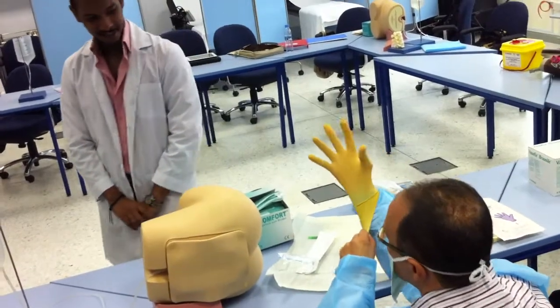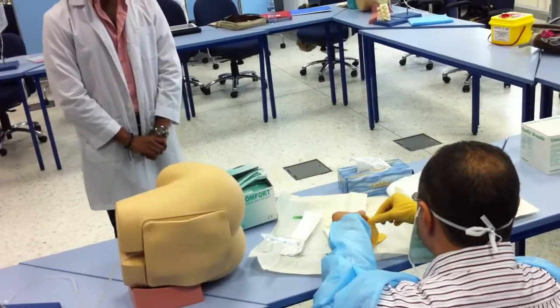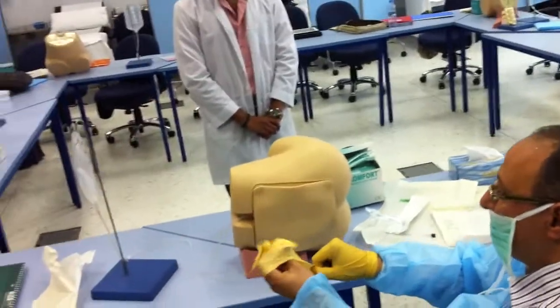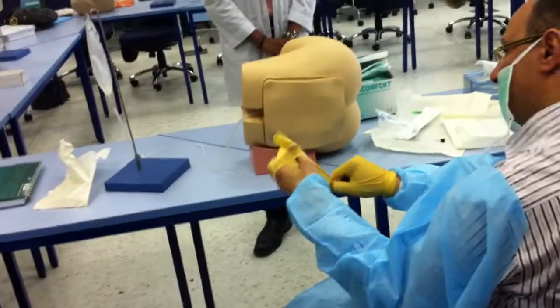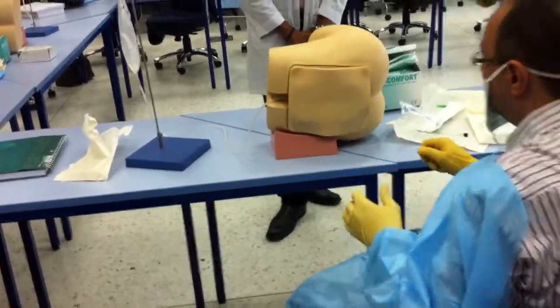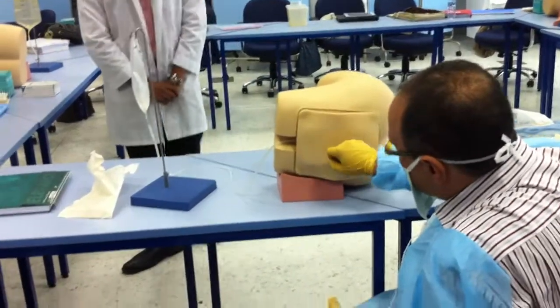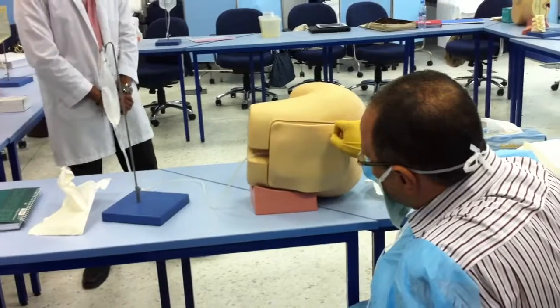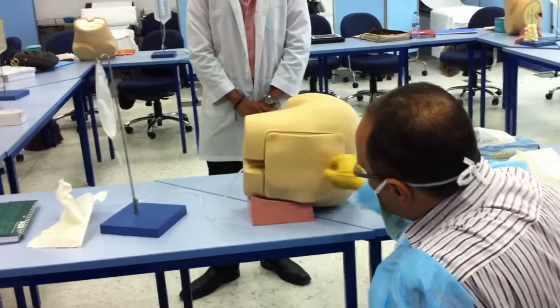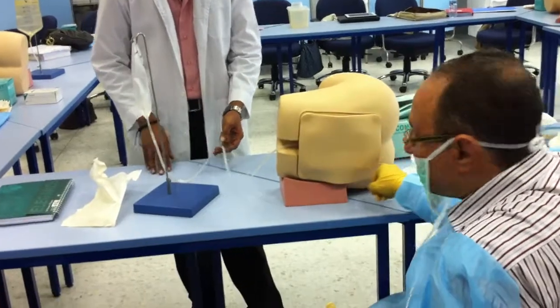This is the technique. I'm going to start sterilizing either in the circular technique towards the outside, or the vertical technique — going from the midline laterally. From the midline, going laterally on both sides.